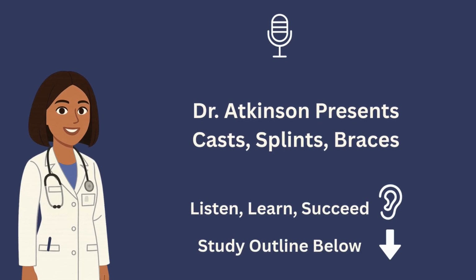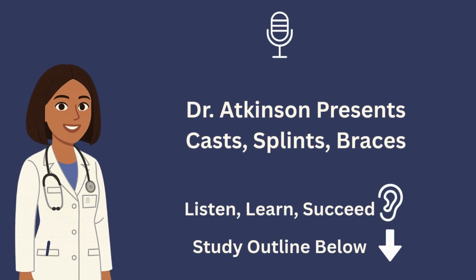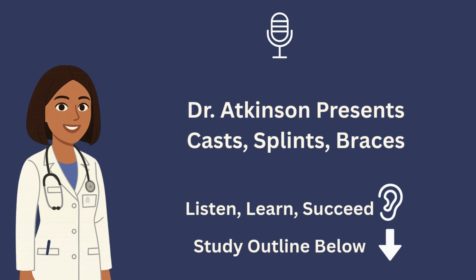Today's lecture is about casts, splints, and braces, some of the most common immobilization devices used in musculoskeletal care. We'll cover their types, uses, complications, nursing management, and what patients need to know for home and transitional care. Casts. The basics. A cast is a rigid external device molded to the shape of the body.